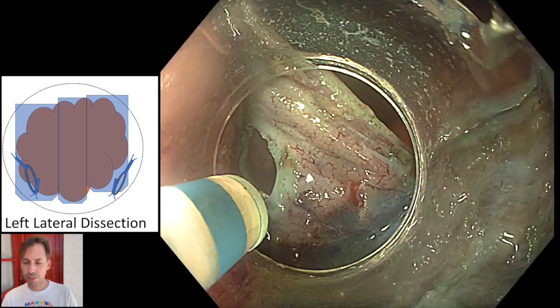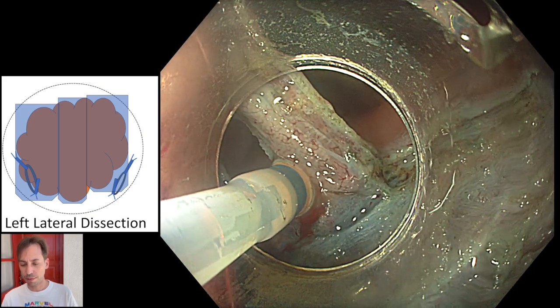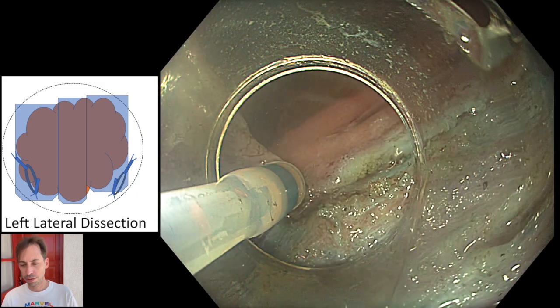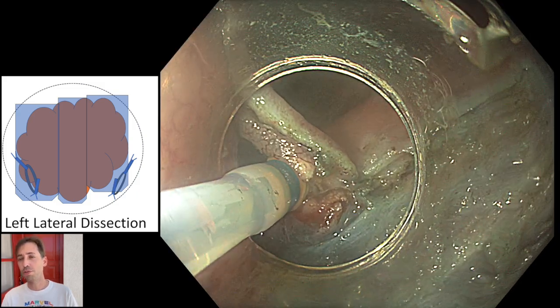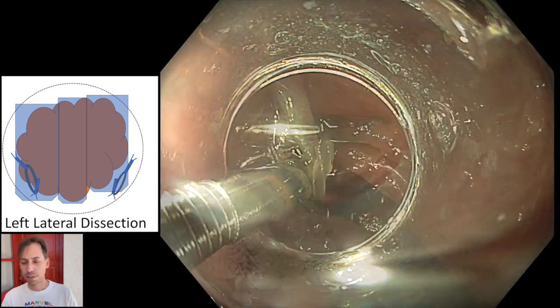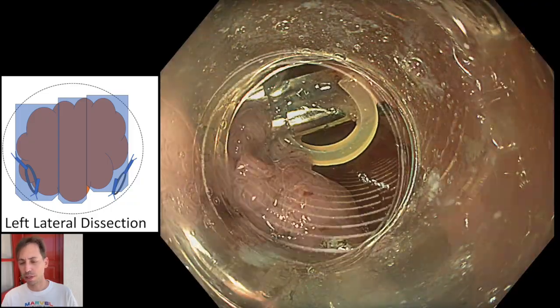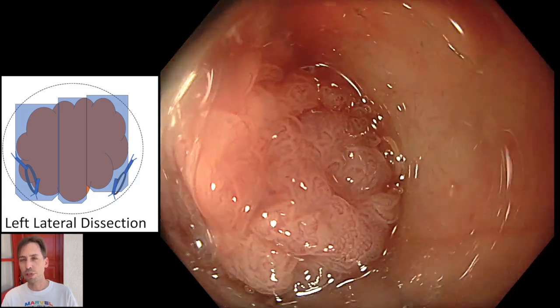So here we reach the end of the dissection at the left side. So the procedure is almost done. Here you may question why I switched to another knife. I had some kind of dysfunction with the last knife, and I had another knife available, and I used it. This was a dual knife.